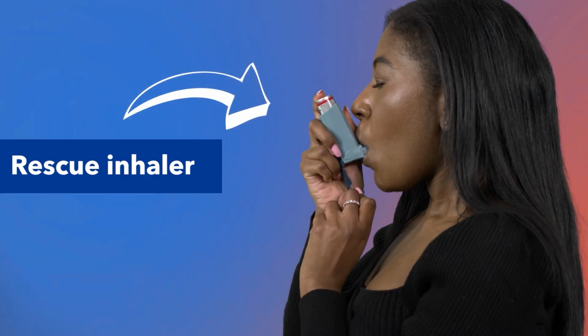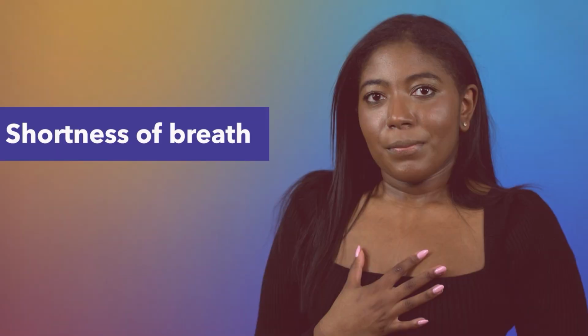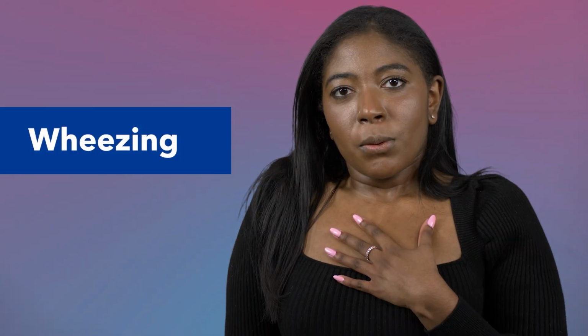You will use it every time you use your rescue inhaler or nebulizer for asthma symptoms like coughing, shortness of breath, chest tightness, or wheezing. By doing this, you will decrease the number of times you have asthma attacks and reduce asthma symptoms.